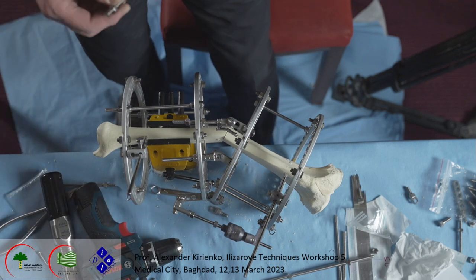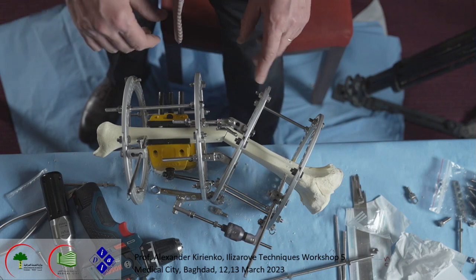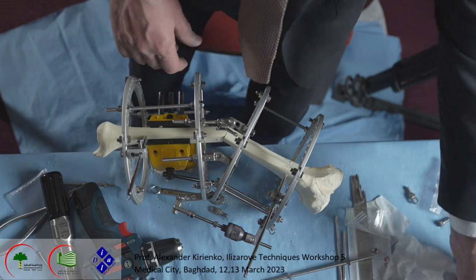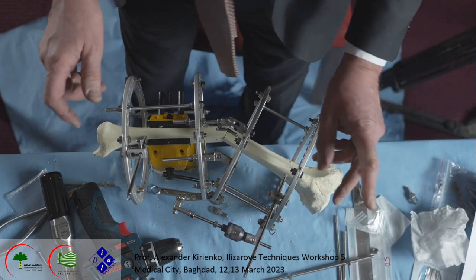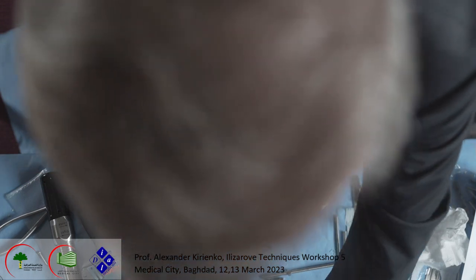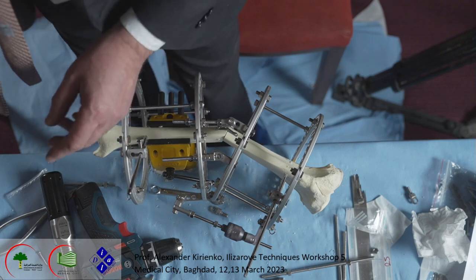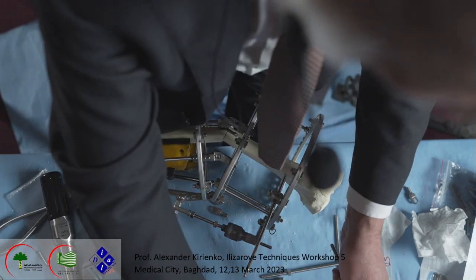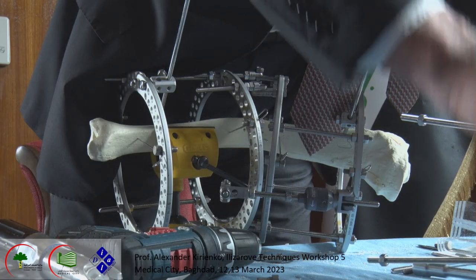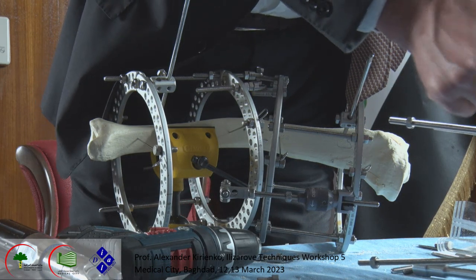Another system we may use, from the lateral part we take another two-hole post. It was in another frame again. Okay. Remove this, because the hinges should in any case be at the same level.